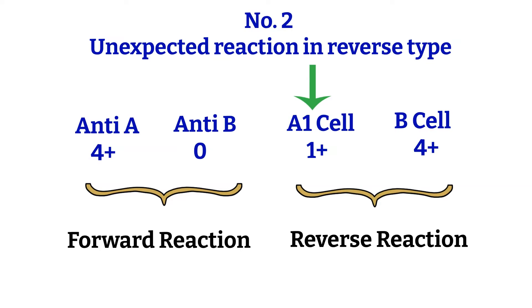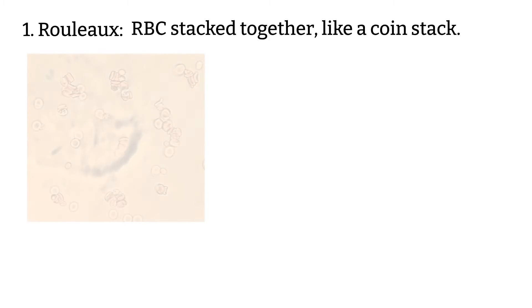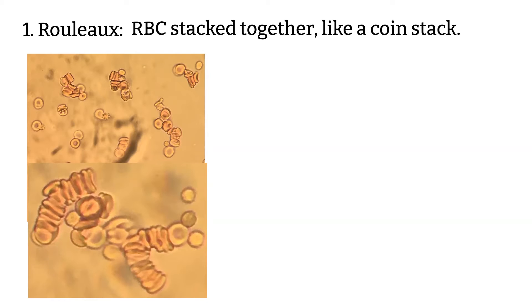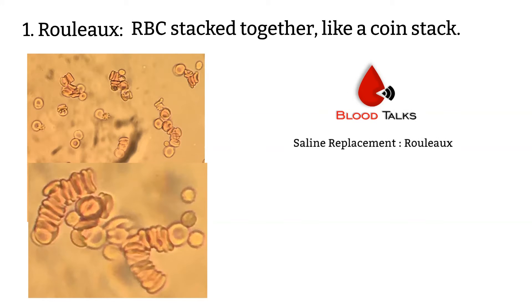What could cause that? Number 1: Rouleaux. Rouleaux should come to your mind right away. This is a condition where the patient's red blood cells stack together and look like a coin stack. It is easily identifiable when you look under the microscope. If you are doing tube typing, take a look at it under the microscope and you will be able to identify it right away. Now that you have identified that Rouleaux is causing the issue, you can do a saline replacement and that should solve your problem. I have a video about saline replacement that tells you step-by-step, so please check it out at the end of this video. If the saline replacement comes out negative, it confirms that you have Rouleaux and your ABO discrepancy is solved.